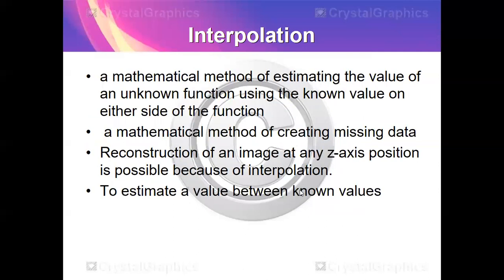Then we also have the term here, interpolation, a mathematical method of estimating the value of an unknown function using the known value on either side of the function. So parang ano lang, when we say interpolation, parang nagsisolve tayo ng x. So isosolve natin yung unknown value using the given value. So yan ang ibig sabihin ng interpolation, which is used naman during reconstruction.